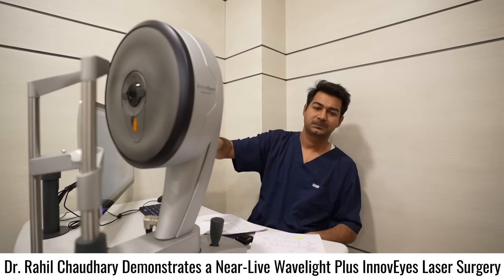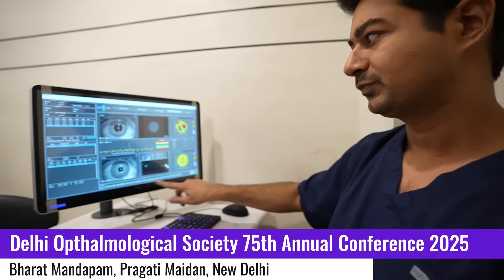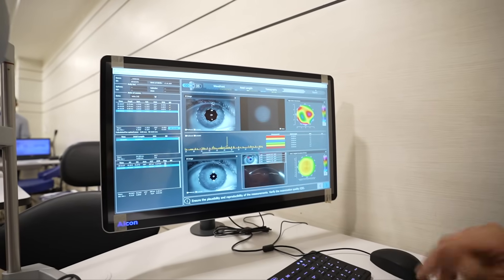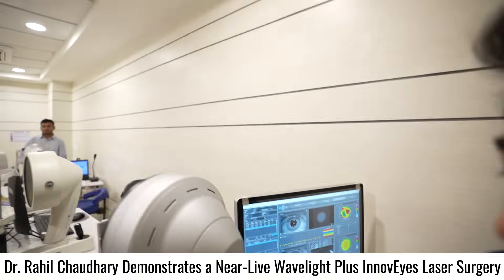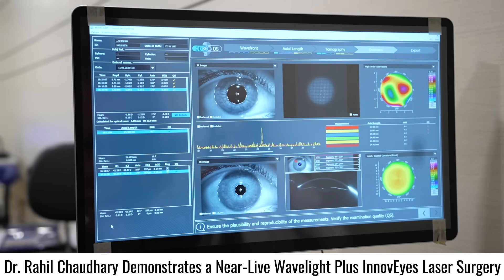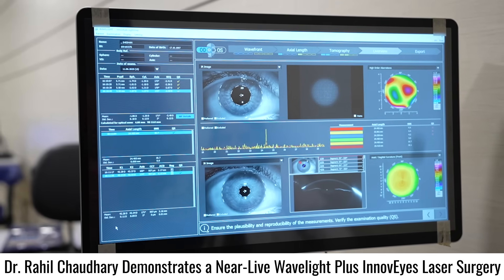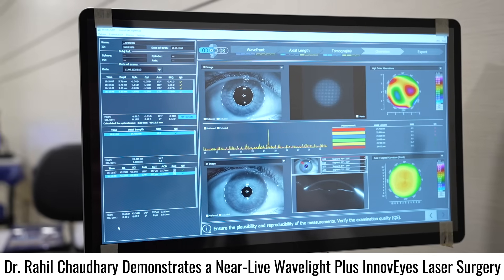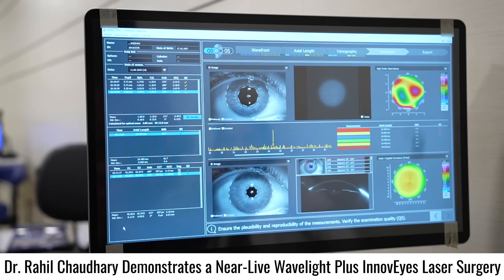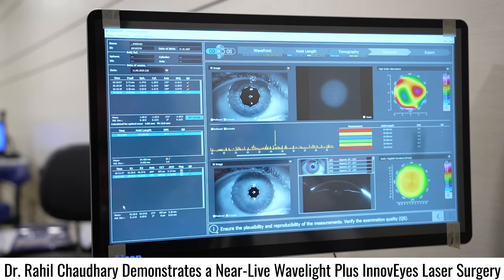At the heart of this technology lies the diagnostic device, the InnoVis Sitemap device. This device is a combination of three technologies: the Hartmann-Shack Wavefront Analyzer, the PCI Interferometry, and Scheimpflug Tomography. They've made it so simple and doctor-friendly — at a click of a button, all your treatment is ready and planned. You don't even have to do a refraction. The data is wirelessly transferred to the EX500 machine. It is now as simple as click and fire.